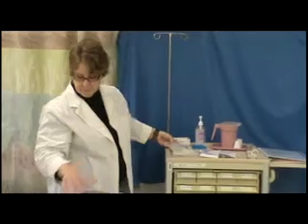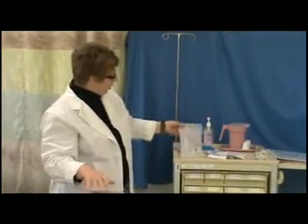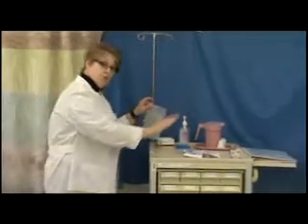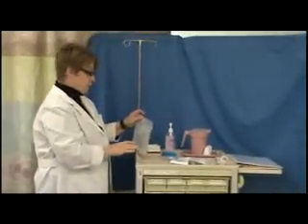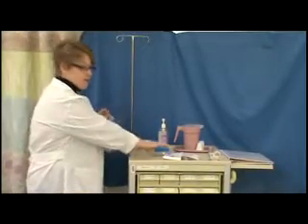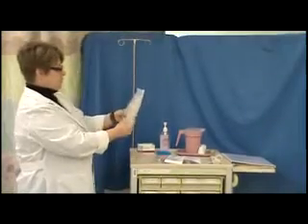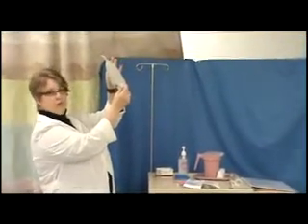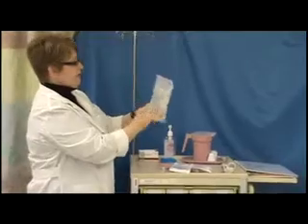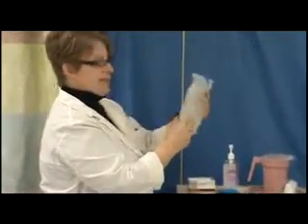Okay, moving on. You've done all these things. What you have to do in this little med room area of the return is to spike your primary solution and prime it, and spike your secondary solution and prime it. So you're going to inspect your solution, hold it up to the light, you're looking for little particles. You're going to see if it's the right thing. You're going to take a look at the expiration date. You're going to check it for patency.